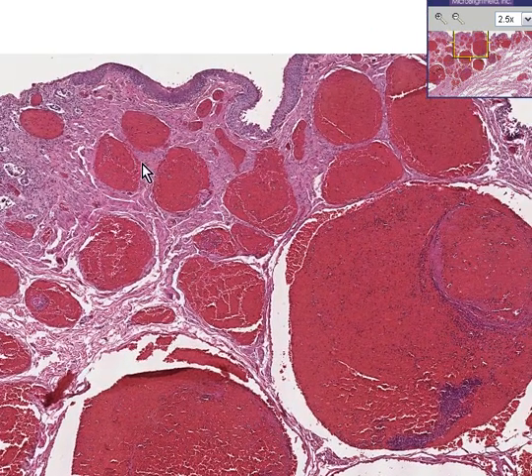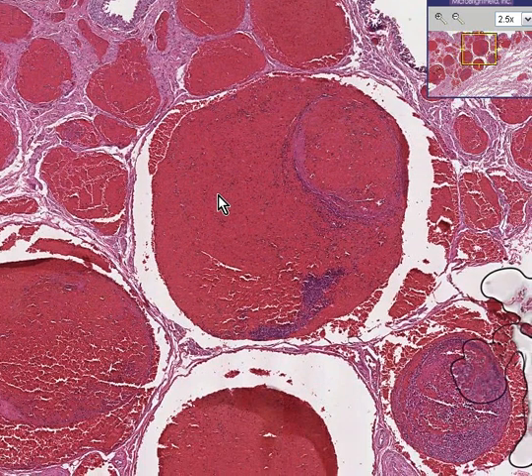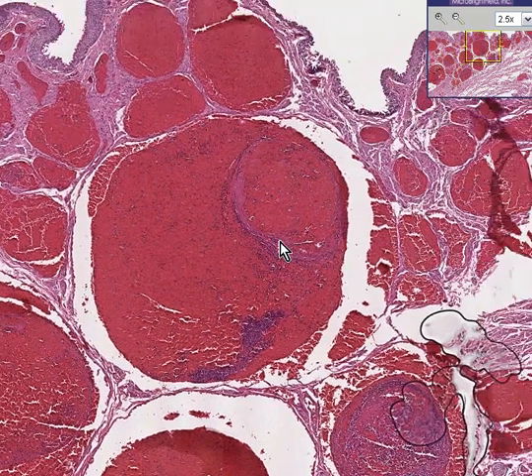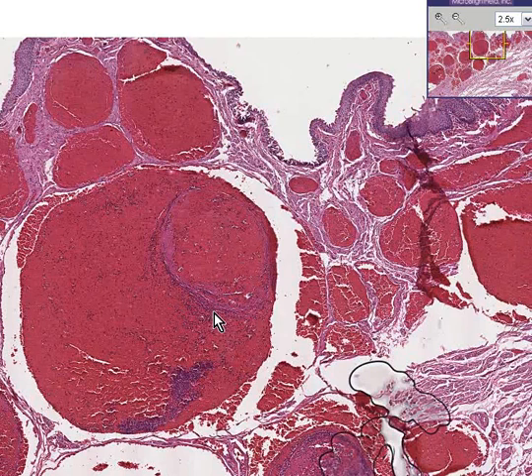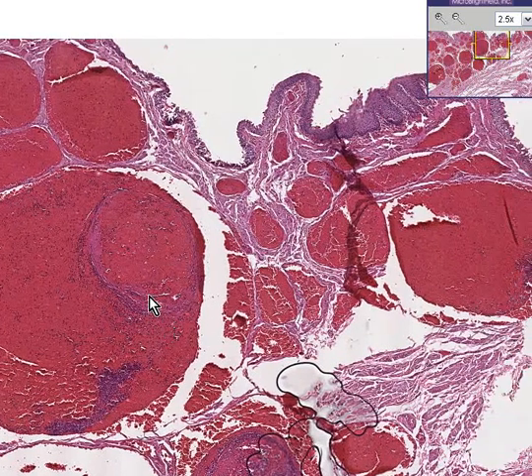They are underlying a squamous mucosa. They are from the anal area. This is by definition hemorrhoids.